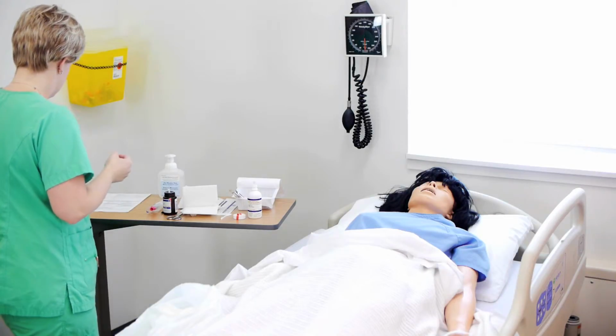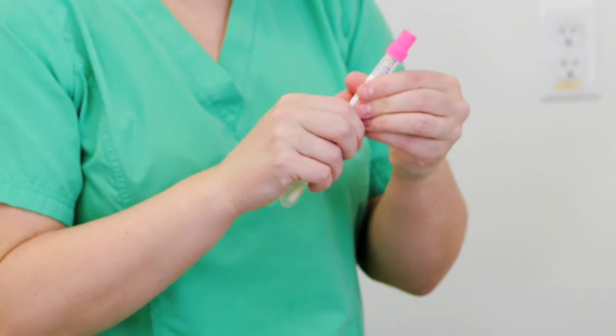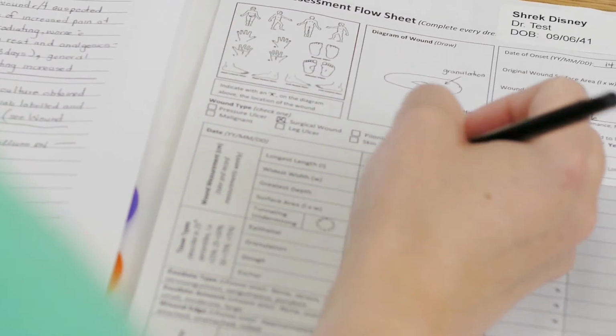Label each specimen tube and verify information in front of the patient. Make a notation on the label if the patient is receiving antibiotics. Document if you administered any pre-procedure analgesia.